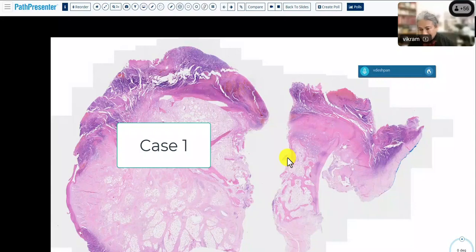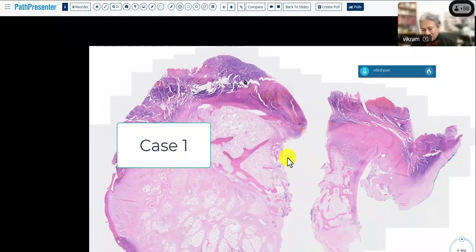Front, because remember, a lot of these are curettings and biopsies. So let me put that out there right up in front. I think it's important to remember. So back to this specimen, just at very low power. This is probably a toe. This crud on top, this blue stuff, is the ulcer, and then you can see underlying bone here.